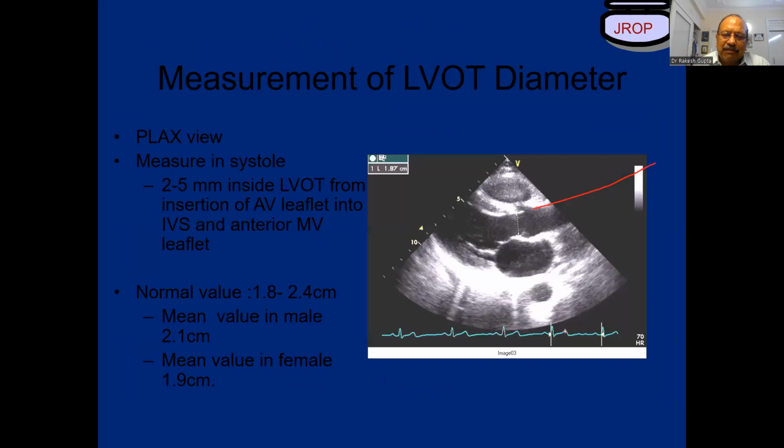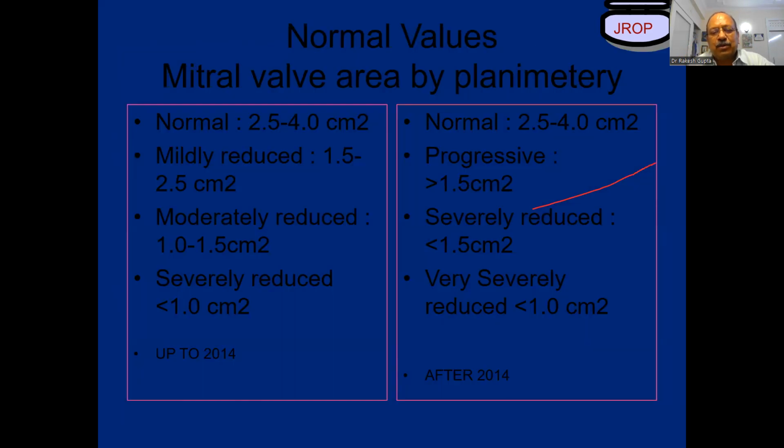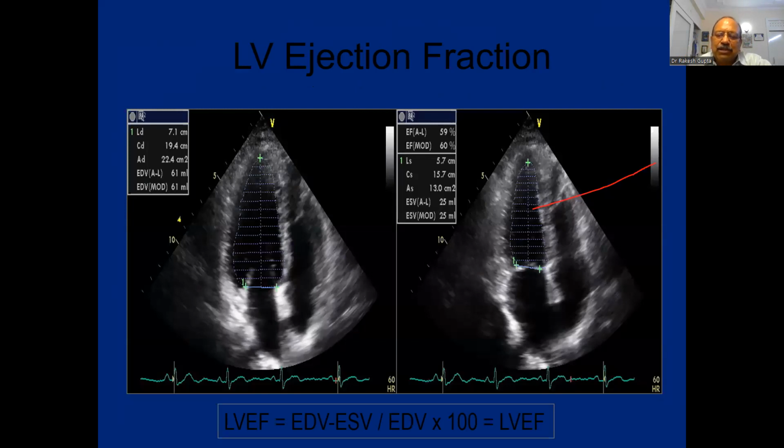We looked at aortic valve area, LVOT dimensions, and then coming down to the next step is calculation of ejection fraction. I'm sure all of you do ejection fraction by what? The most common thing everybody does is eyeballing. Well, I don't see myself doing eyeballing for all these kinds of things, and similarly, I don't expect you to do eyeballing to come to a conclusion at the learning phase of echocardiography.